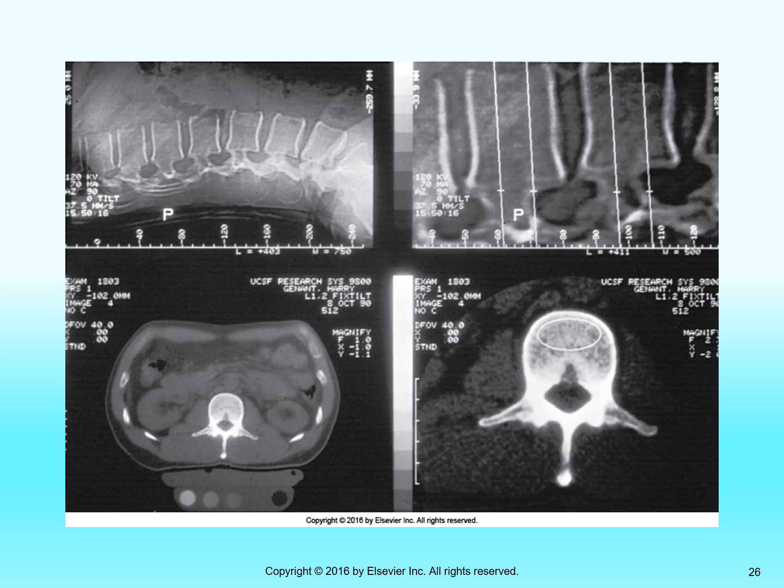So these are actually CT scan images, and some of your CT scanners now have been outfitted with bone densitometry subroutines and protocols, so you can actually do it as a CT scan tech, if you have the right software downloaded. Again, you've got to have the bone densitometry software package.